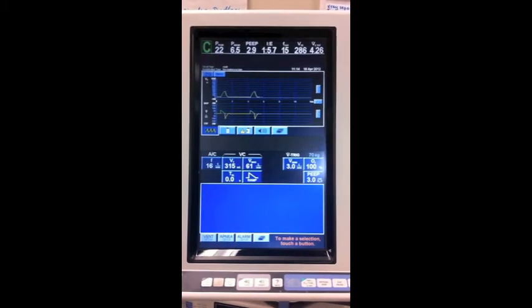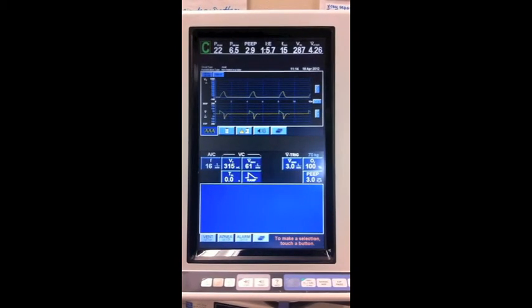So, questions? That's pretty much everything. All right, so I'm going to turn this one off. I'll get your labs. We need to get the other 5 vents out of the hall, and let's break up.